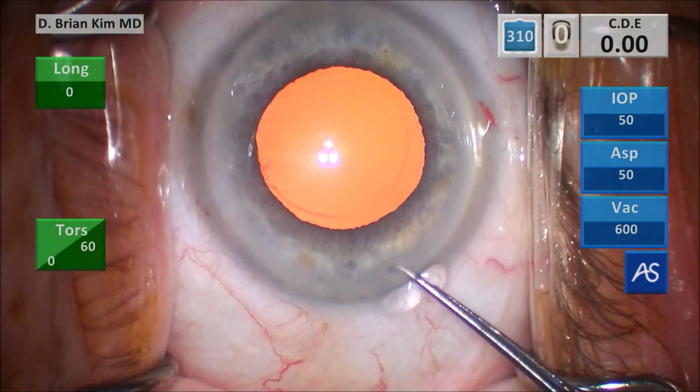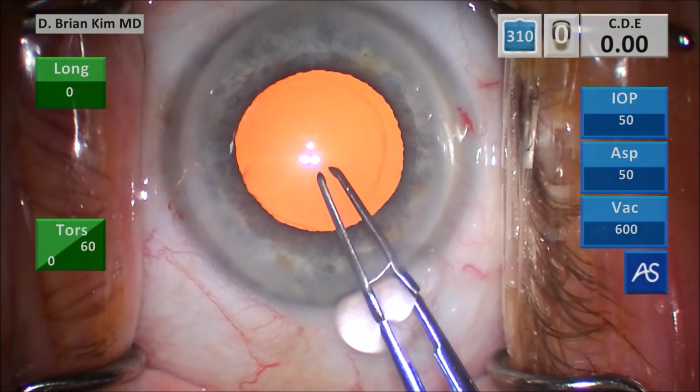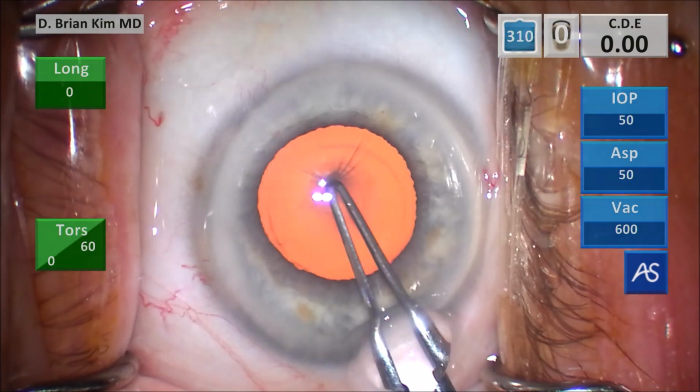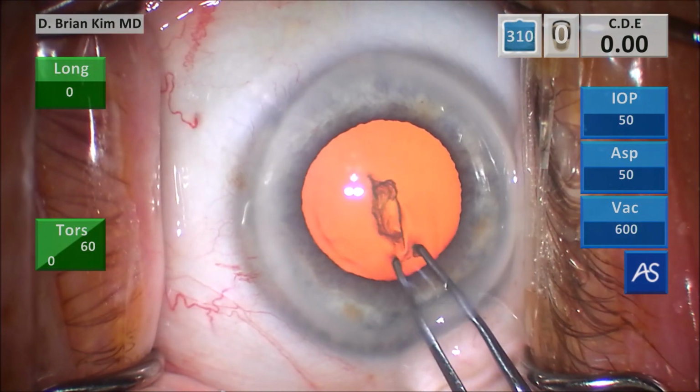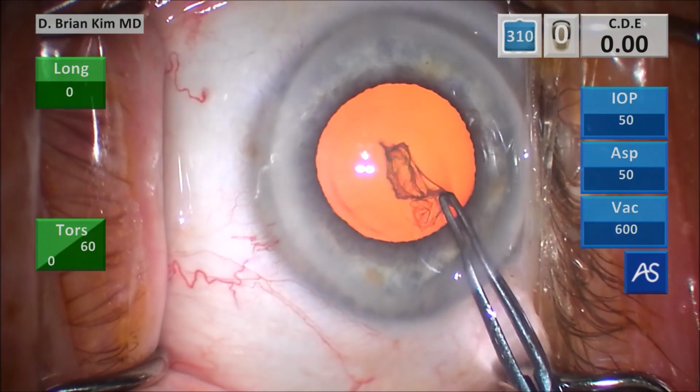Go in with the forceps sideways. I puncture the center, pull towards me, and then sweep a little bit to the right, which creates a little bit of a tear and a flap. Grab the right side of the tear, and I go around circumferentially.